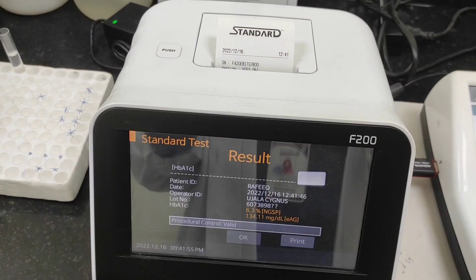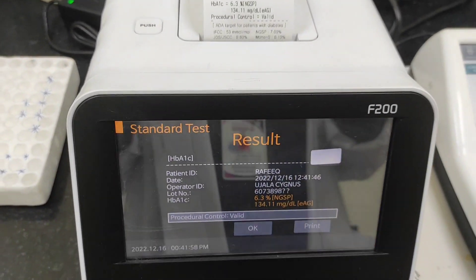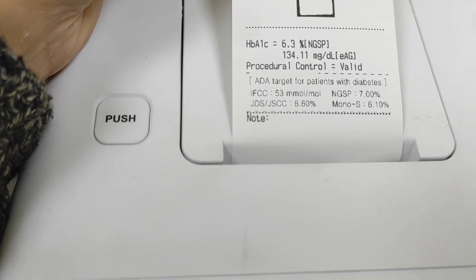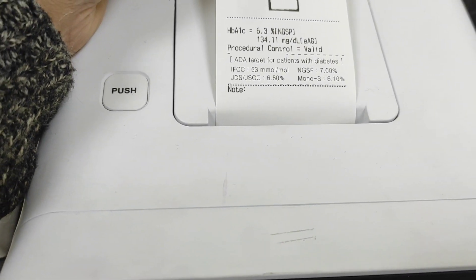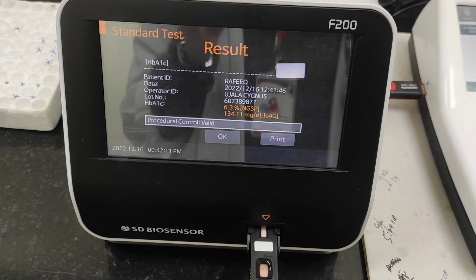The test is completed and we get the result in printed form as well as displayed on screen. The result is 6.3 and 134 — that's the average. So this is it, guys. I hope this video was useful to you.